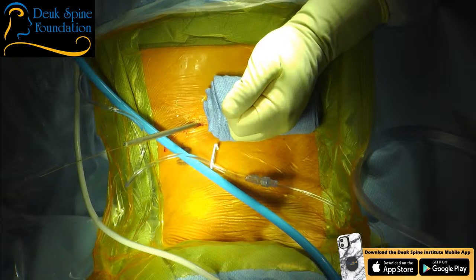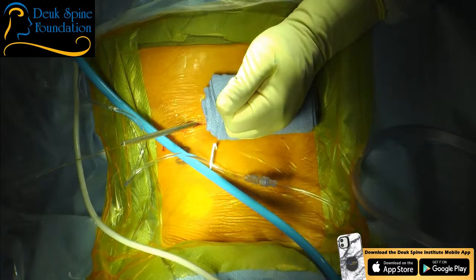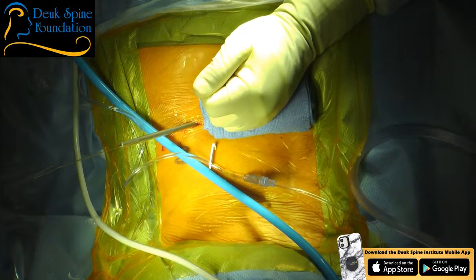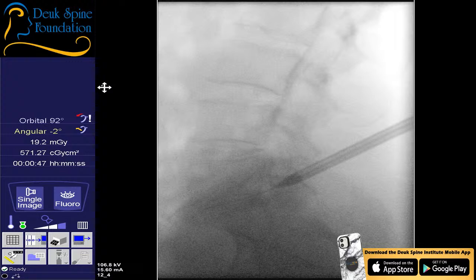All right, I'm not seeing well, Jordan. You've got to be fixing that. I shouldn't have to tell you. So I think you've got to fix this. I think this side has to come down. And I think you may have to wag a little bit. You can see a double shadow on the back of the vertebral body. I think you just made it worse, but go ahead. Shot. Okay. Now right there, maybe better. Okay, so there's still, I think you're a little too far north, but I don't know if you could wag that out and make it better.